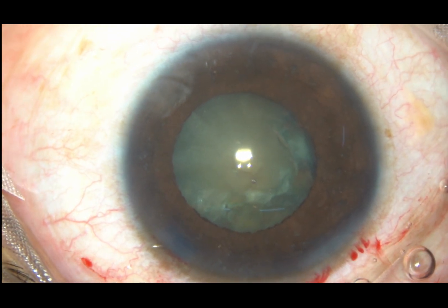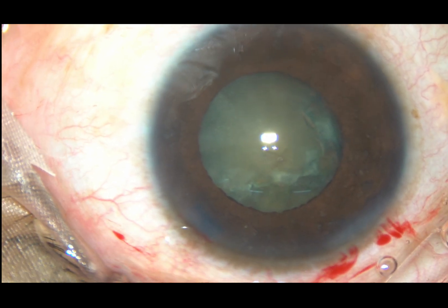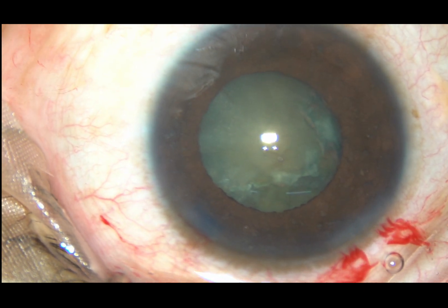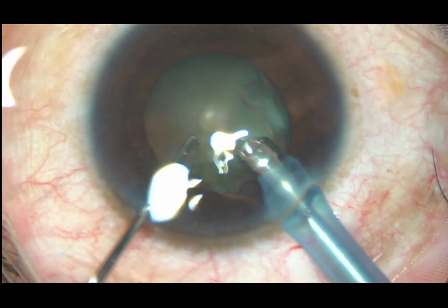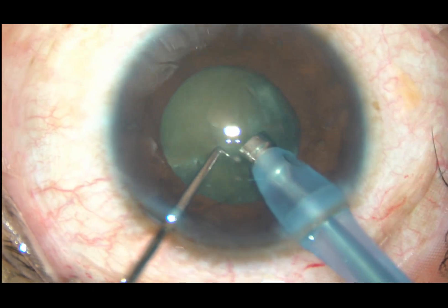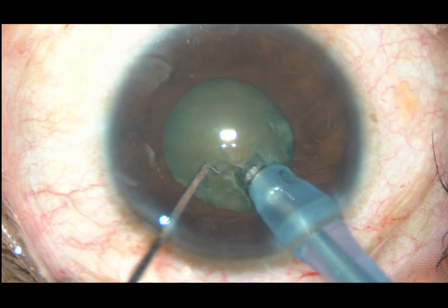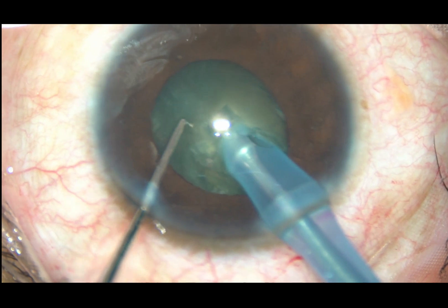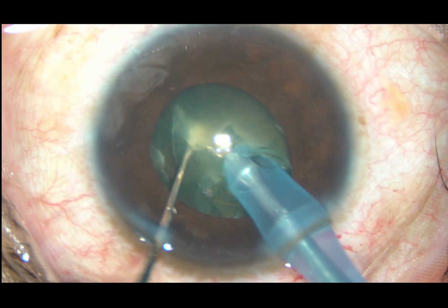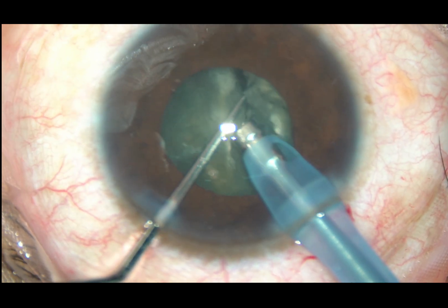Viscoelastic substance is injected again and now the tip of the phaco handpiece is introduced into the anterior chamber. Since the pupil is not well dilated, in this case I have planned vertical chop. To do vertical chop: bury the tip into the substance of the nucleus, have a nice groove onto the nucleus, be at the center, and now use the chopper — bring it close to the phaco tip and divide the nucleus.